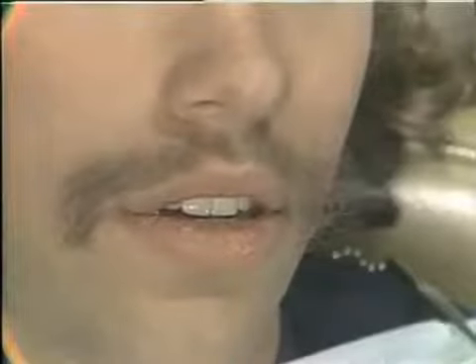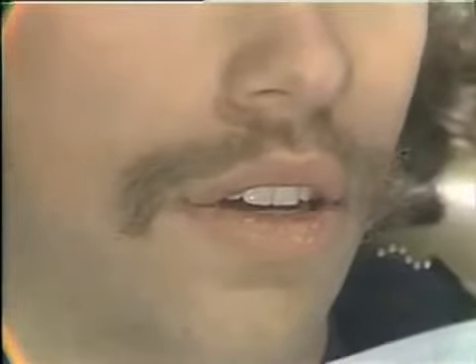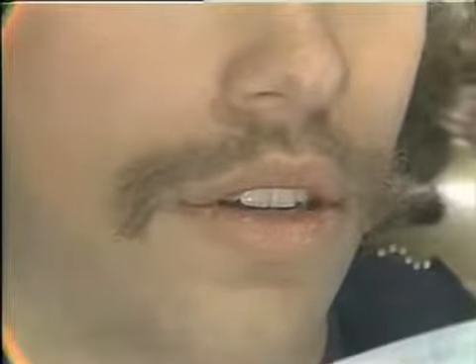Let us now turn to the patient. For purposes of showing this area better, my assistant is going to retract the cheek on the opposite side so that you can see a little better. Andy, if you'll just open real wide for me, please.